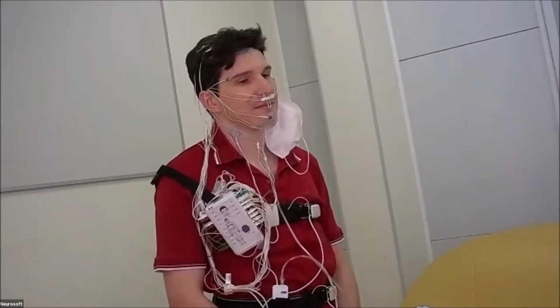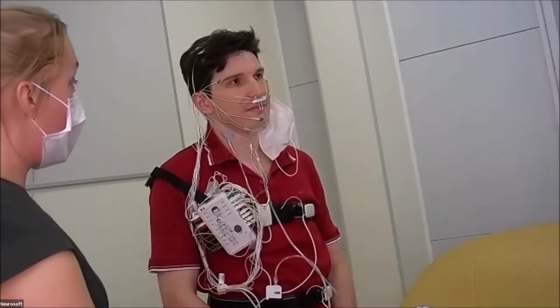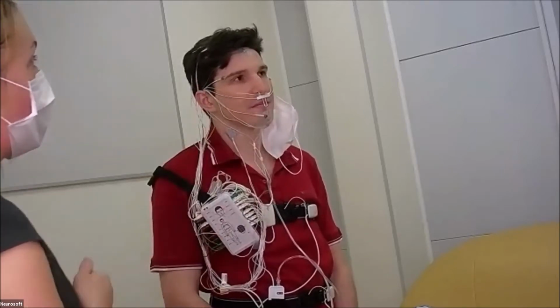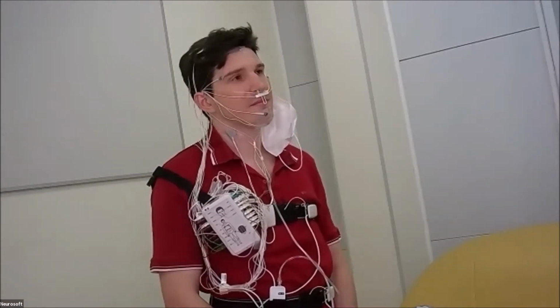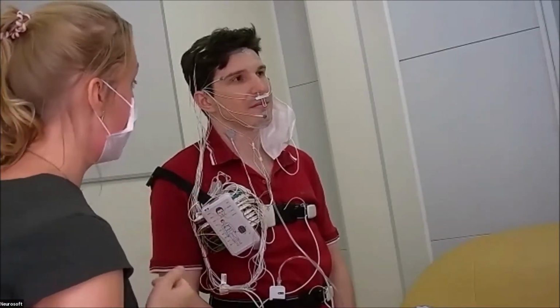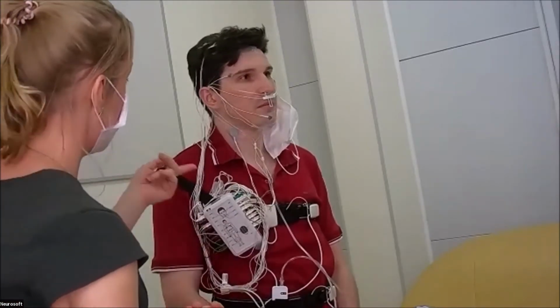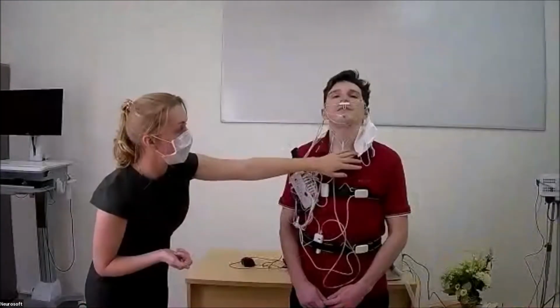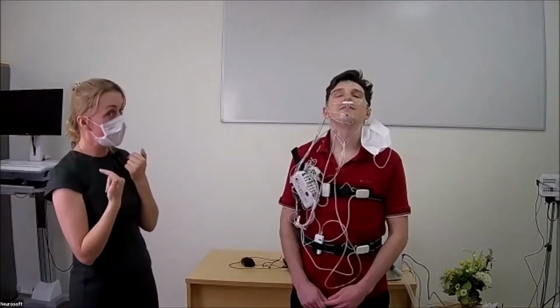So the first electrode we put 1 centimeter above the inferior edge of the mandible at the midline. So this is the electrode above the mandible. The 2 other electrodes we put 2 centimeters below the inferior edge of the mandible, 1 electrode 2 centimeters left and the other electrode 2 centimeters right from the midline.